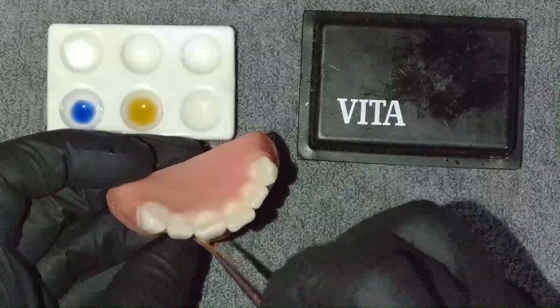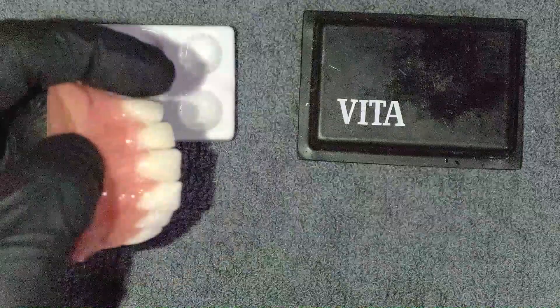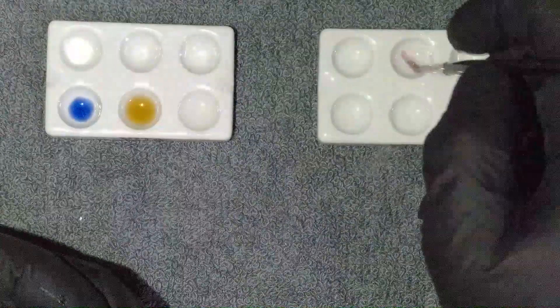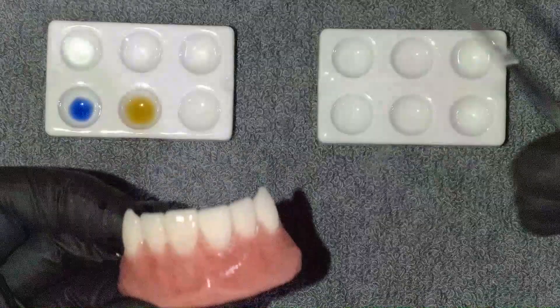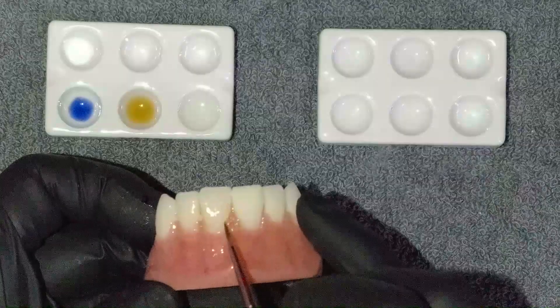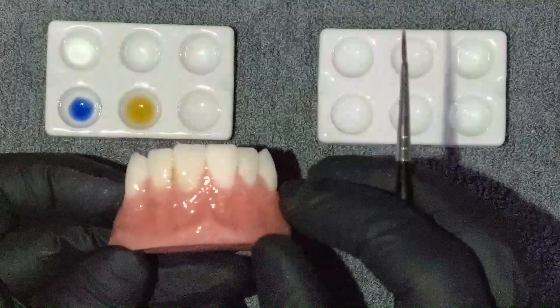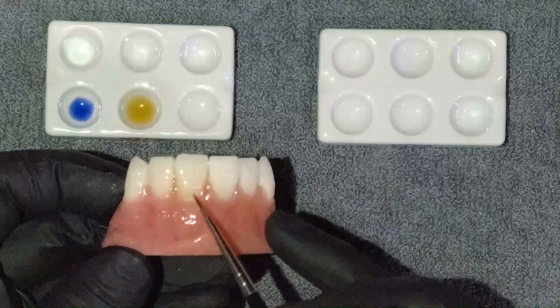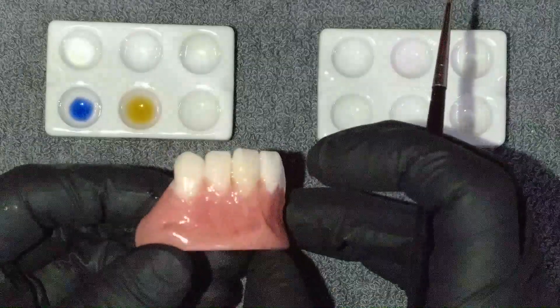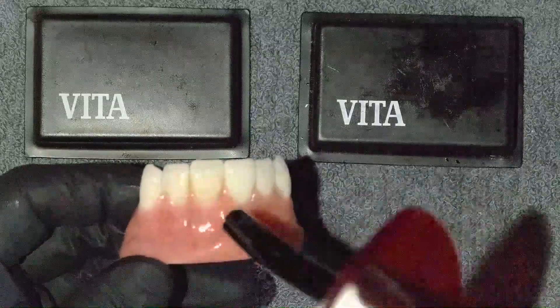If we end up with a little extra coming over the top and giving us some extra characterization, that's okay too. Then finally I'm going to come in with my chroma. You can do this either way — chroma first or color first, it doesn't matter, it's totally a personal preference. I always add a little bit in the interproximals and down at the base. We don't want it too even, so we're going to massage it in until we get it where we like it. I'm going to tack it, see where it's at, and see if I need to add any more.